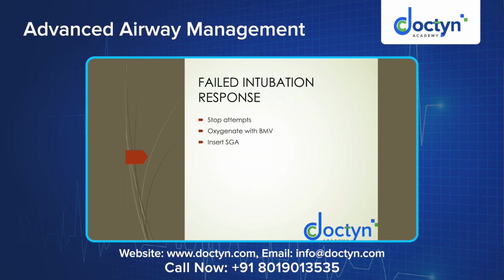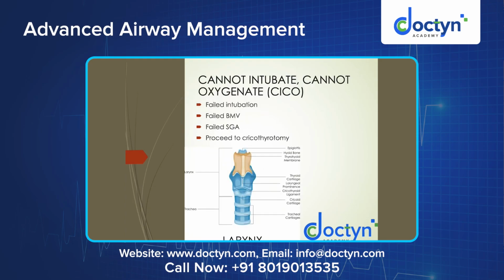Failed intubation response. As I said, anytime you recognize that the intubation is not happening. So far we have discussed successful intubation, where you are able to visualize the cords, number one. Number two, you are able to visualize the vocal cords, but you are not able to pass the ETT. You have passed, but it is causing trauma and more bleeding, and you are taking it out, but not able to visualize. So there are any number of reasons intubation fails. But the wisest thing to do is identify early, so that you will be able to rescue the oxygenation. So stop the attempts, maintain the oxygenation with bag mask ventilation, insert the supraglottic airway device.